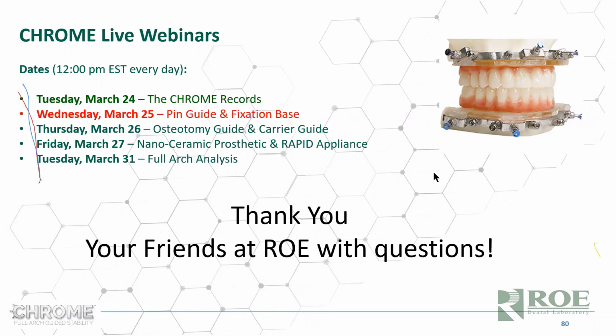Any recommendation for scanning soft tissue with iTero? Palate is easy, but the vestibule and mandibular posterior ridge has been difficult. Now, I know the trick, and sorry to be a little dodgy on this, but I know the trick with Trios is you use a surgical marker, like an indelible surgical marker, and you paint a grid of dots on the palate. And I think you can do that in the vestibule too, and then the scanner will pick up the dots. I don't know about that with iTero.